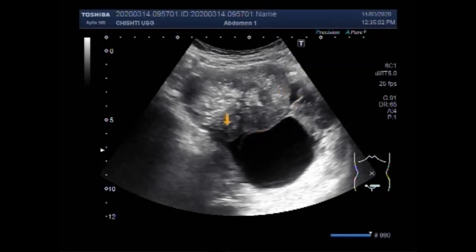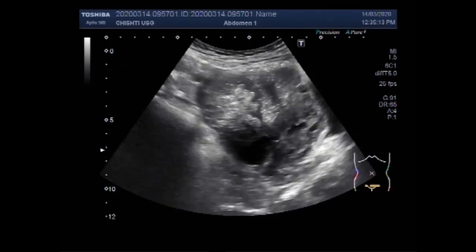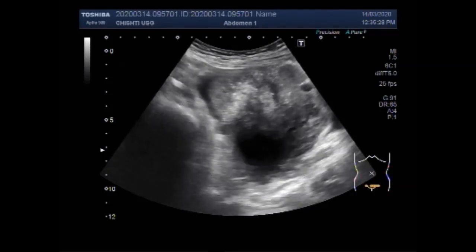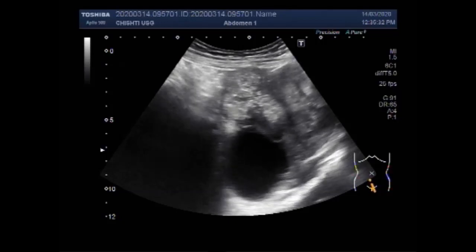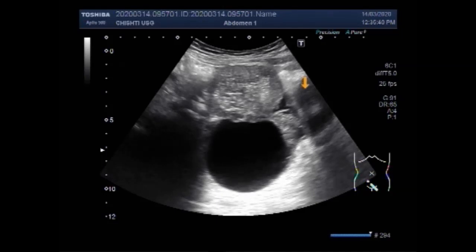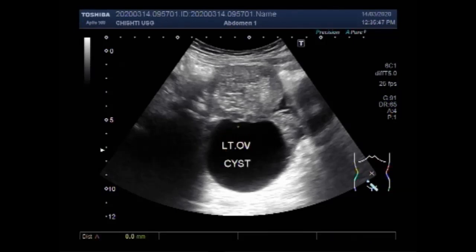This is the right ovary. This is the left ovarian cyst — a large left ovarian cyst — with a large mass in the left ovary adjacent to the uterus. This ovarian cyst is quite large, round to oval in shape, and it measures about 60.5 x 60.6 millimeters.